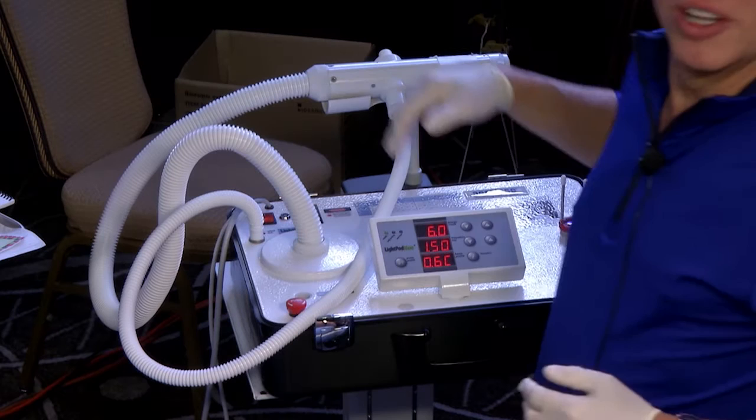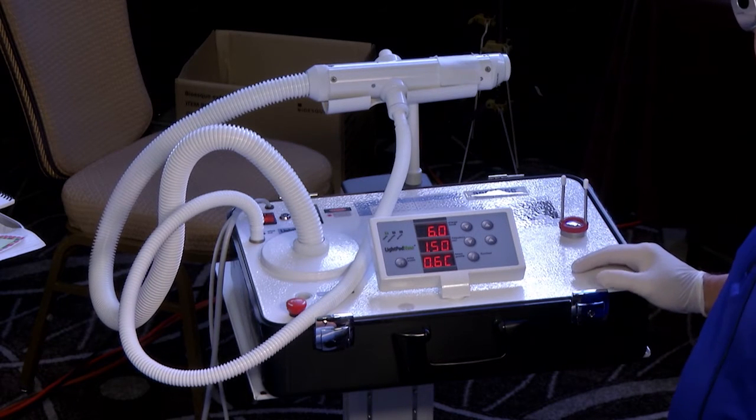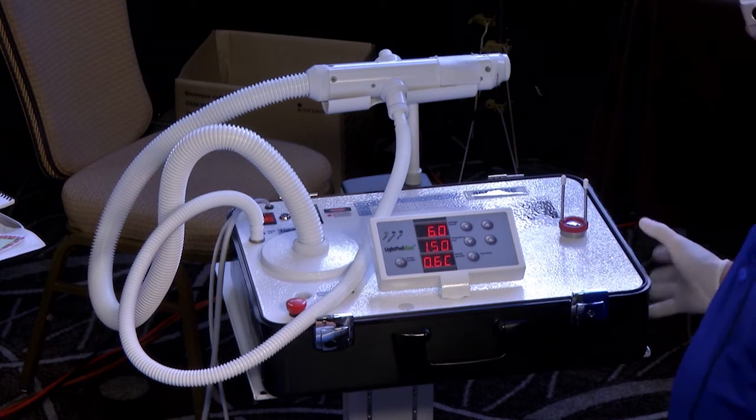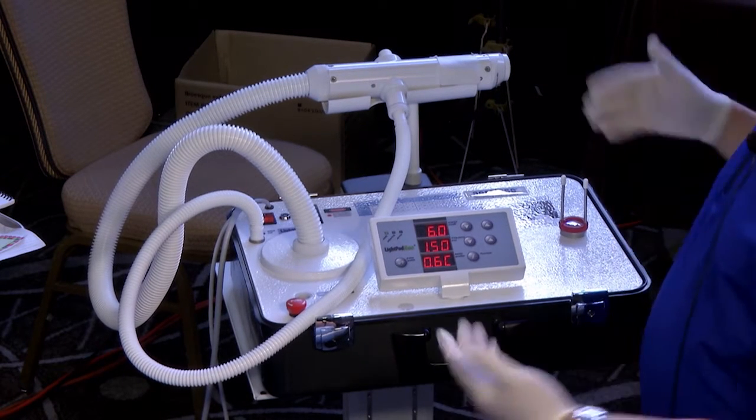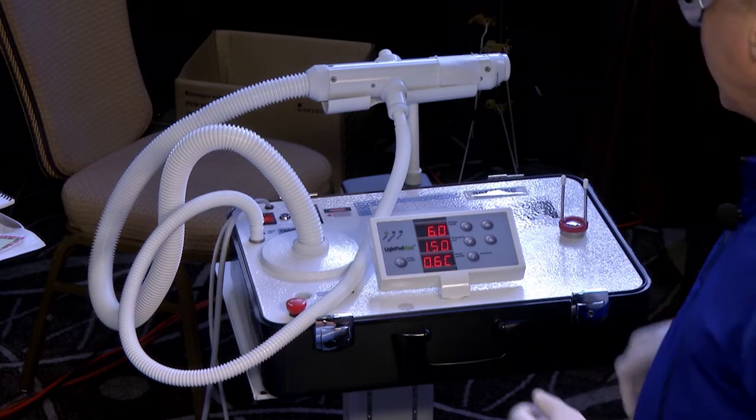We are ready to go. First thing first, we're going to show you the laser. As I mentioned, it's got a very small footprint — it's hard to even call it a footprint. The whole laser is in this little box, which is like a little mini suitcase. It's small enough you can even take it on a plane and put it up above your seat.